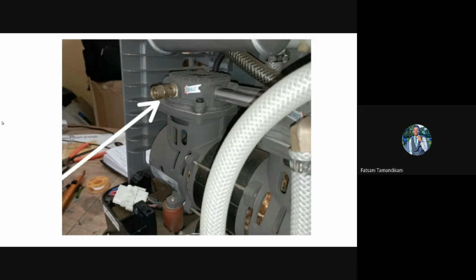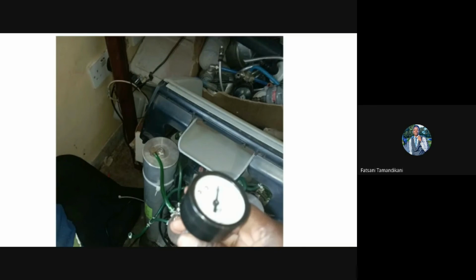Moving on, we're going to look into sieve bed pressure. Inside the sieve bed is where adsorption takes place, and the sieve bed contains zeolite, which acts as a molecular sieve. In order to adsorb atmospheric nitrogen and release it back into the atmosphere, the sieve beds are supplied with pressure from the compressor via the feed valves. These feed valves can be rotary valves or solenoid valves, as Kelvin already explained.